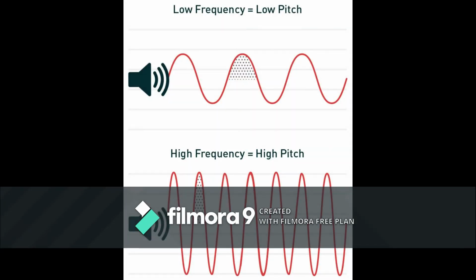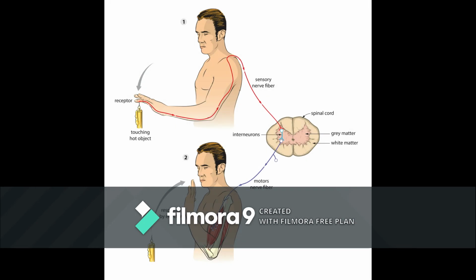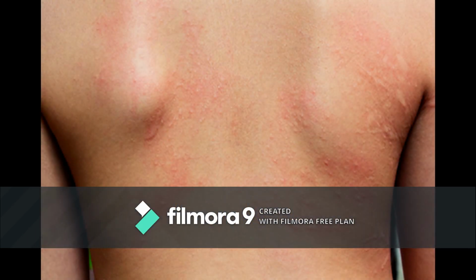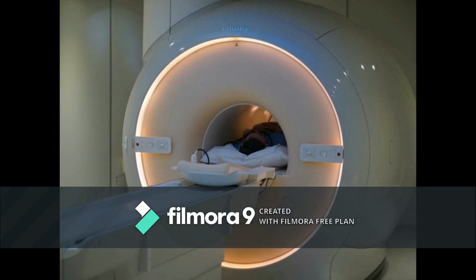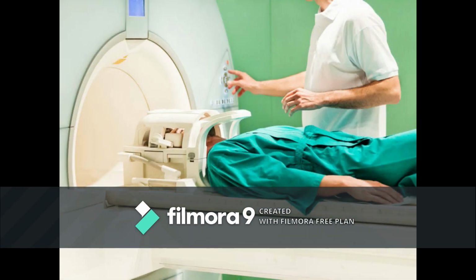As well as machine limitations, there are many risks which can harm the patient, including that the machine may produce loud knocking noises affecting the patient's ears and peripheral muscle or nerve stimulation if no ear protection is worn. The use of gadolinium-based contrast agents may produce side effects for the patients, creating allergic reactions. Claustrophobia can also be experienced by the patient as it is uncomfortably small. To produce quality images, patients must remain stationary, which may be difficult for small children and infants, who may need to be sedated or anesthetized for the procedure, which may carry certain risks such as difficulty of breathing and low blood pressure.